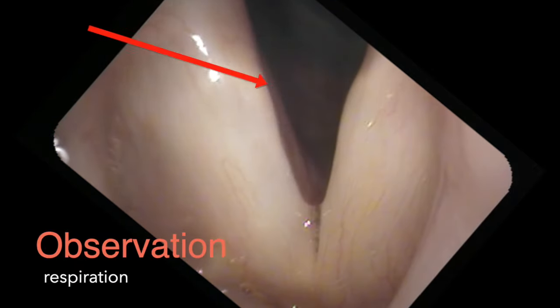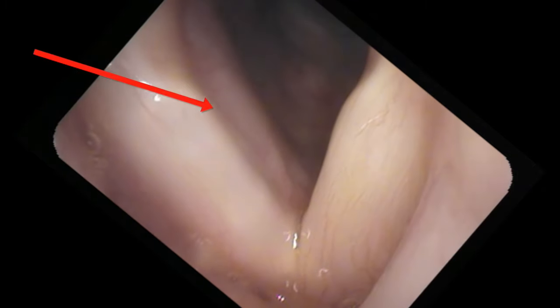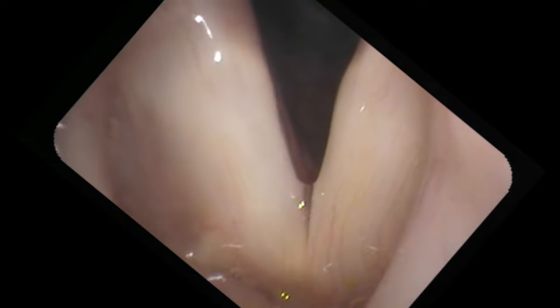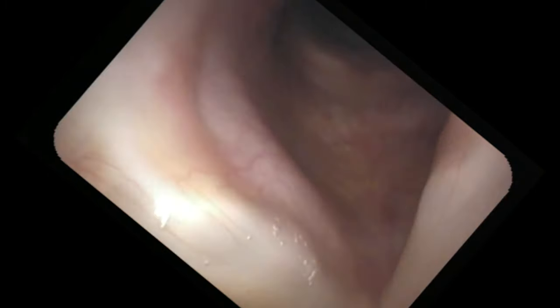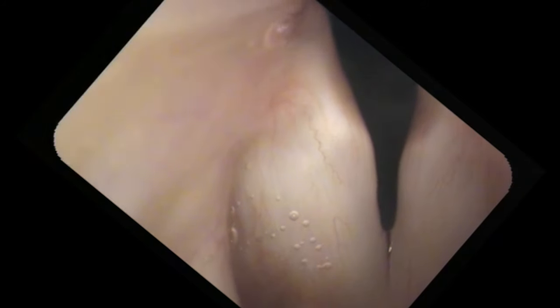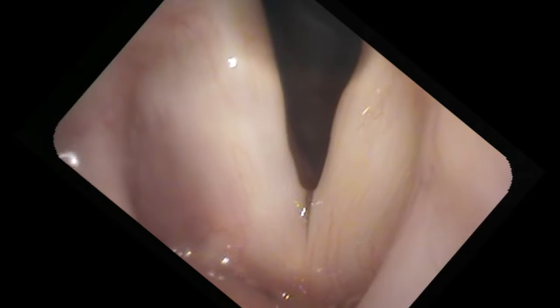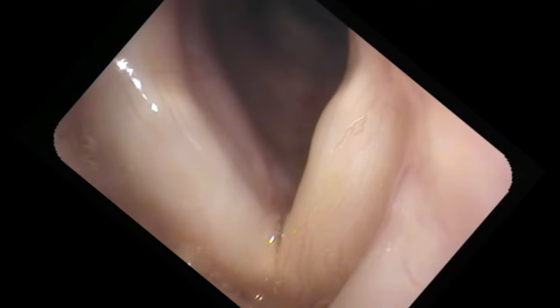And here we're watching the right side acting normally. The right vocal process during respiration is completely opening during inspiration and closing during expiration. And the left vocal process is perhaps moving, and it is moving at the correct time - medially during expiration and laterally during inspiration. But the degree of rotation is minimal when compared to the right side.